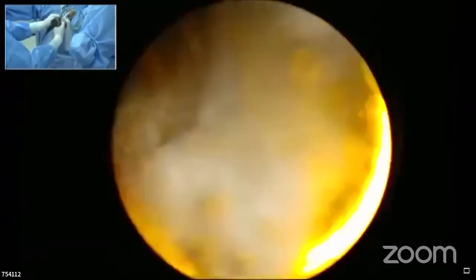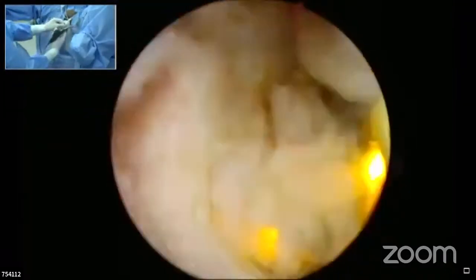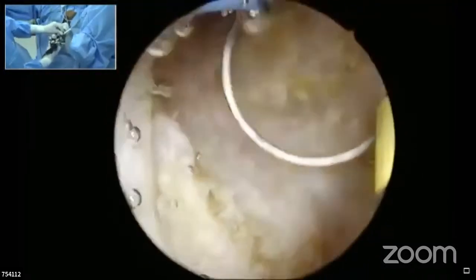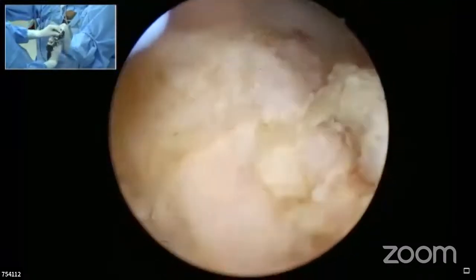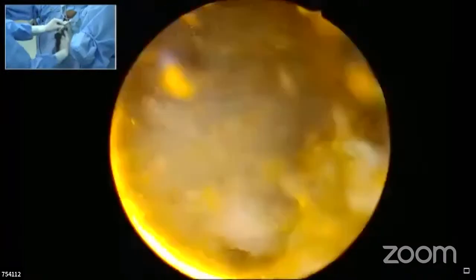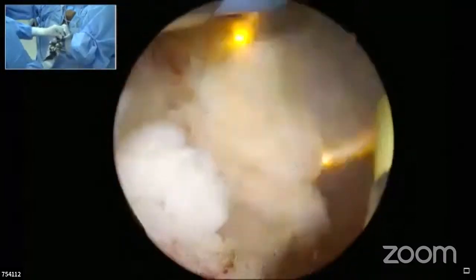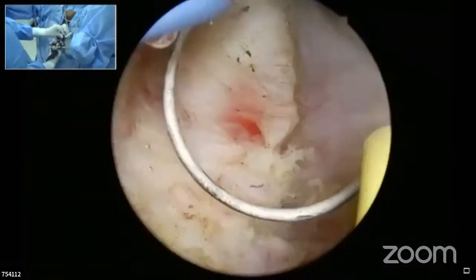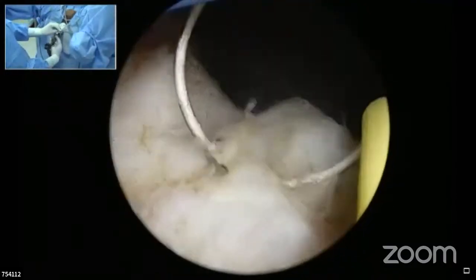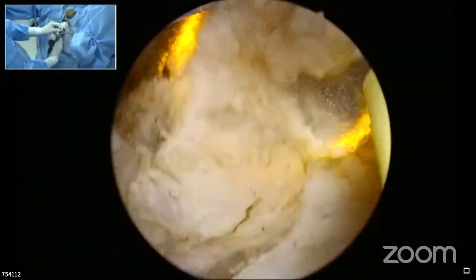This is replicating the principles of enucleation with the dissection loop, sir. What we do with enucleation, we use either bipolar energy or laser, whatever we use, we do the same thing. We try to detach the adenoma from the capsule as much as possible and push it back. So what we are doing is instead of pushing back, we just push it medially and then sort of manually morcellate it. Correct. No, your control of vessels at 11 o'clock and at 5 o'clock was so perfect.